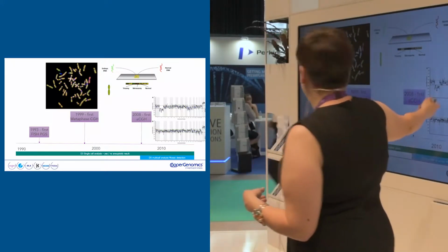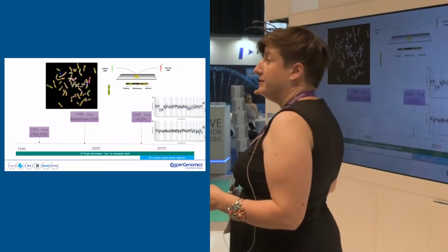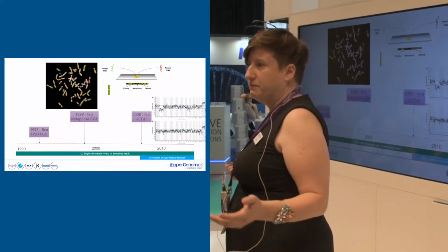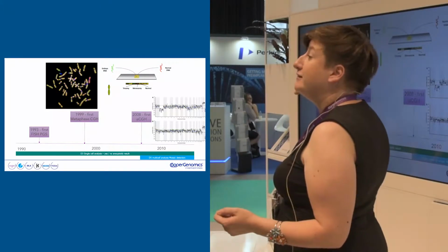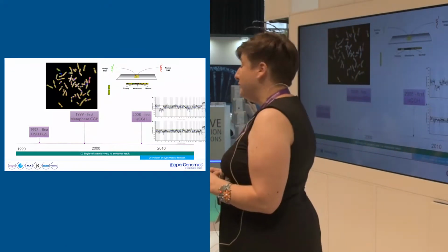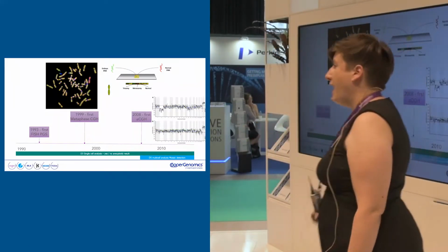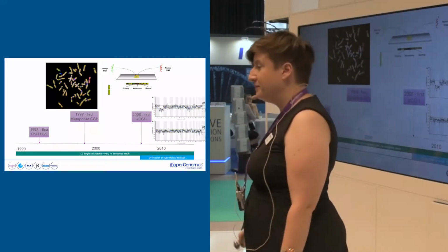And I always like to show these images here, because if I showed them to the genetics lab today and said, what would you call those? They would say, that's a no result, that's a fail. These are the images from the first clinical case. And we transferred an embryo resulting from this, and the patient got pregnant after 14 cycles of IVF.